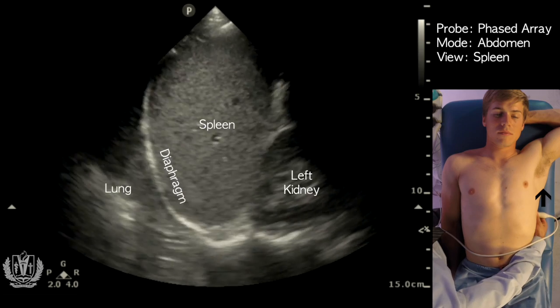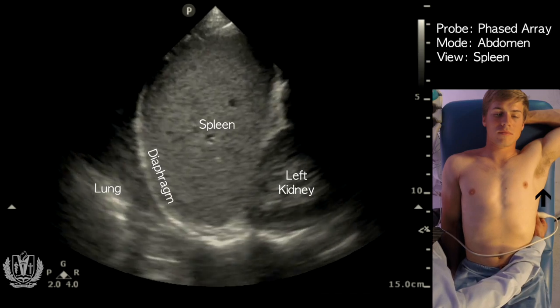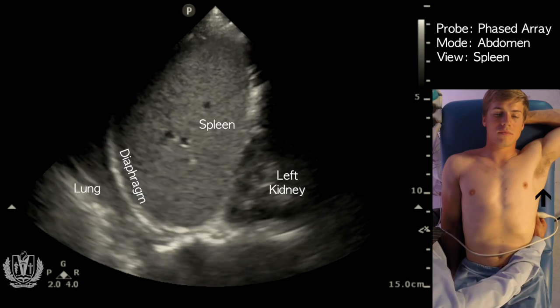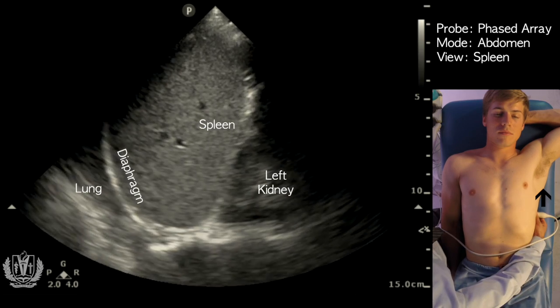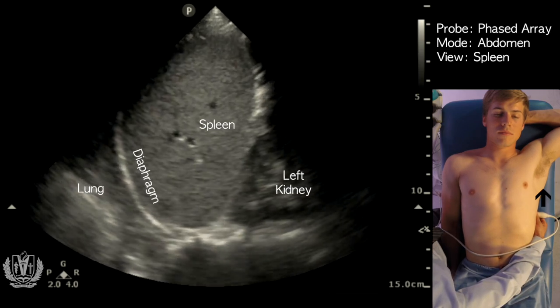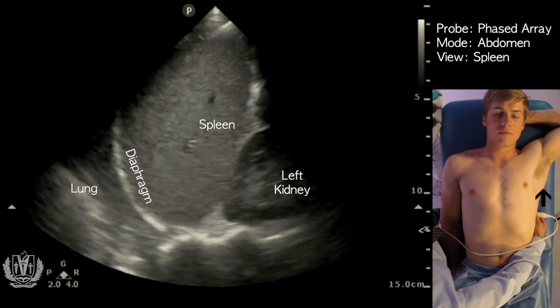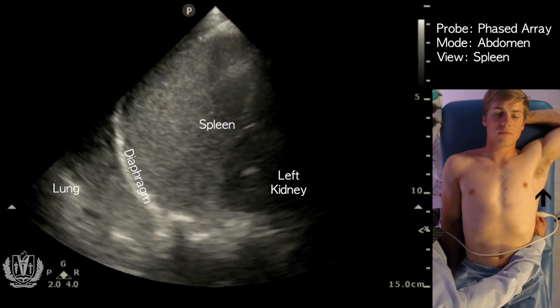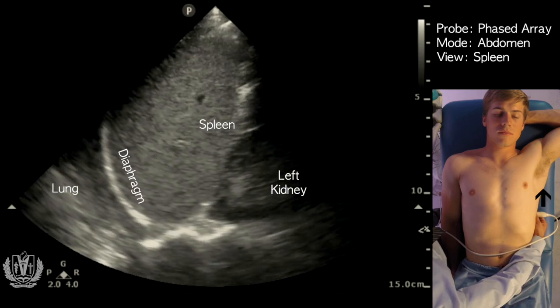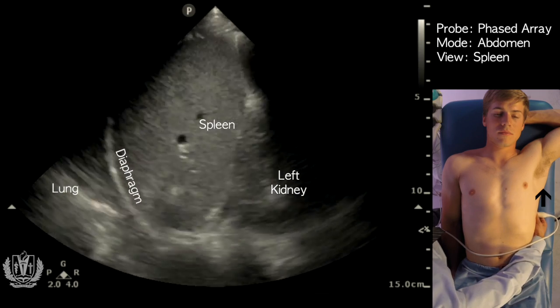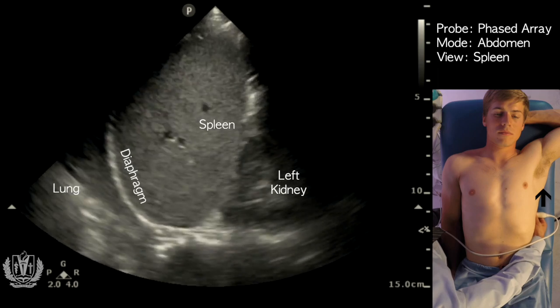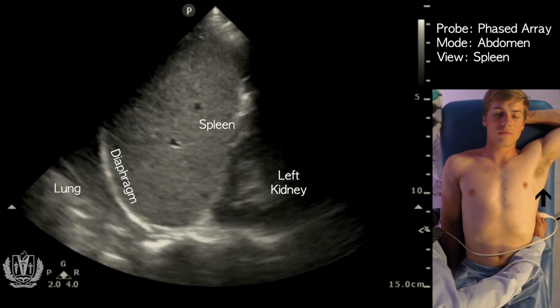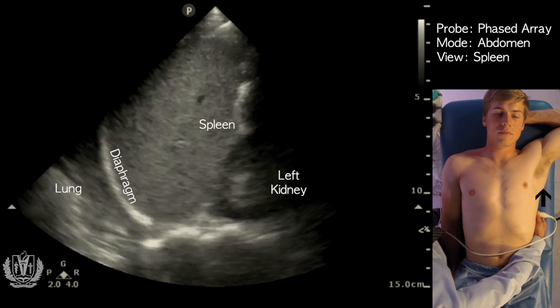For free fluid assessment, fluid will track around the spleen, not in between the spleen and the kidney. You can also measure the size of the spleen using this view.